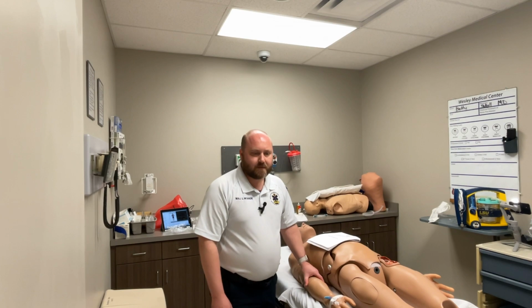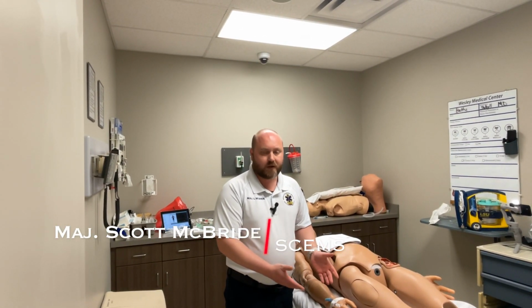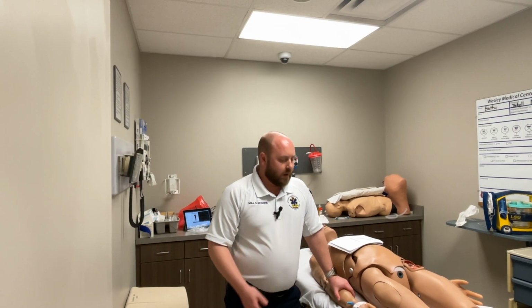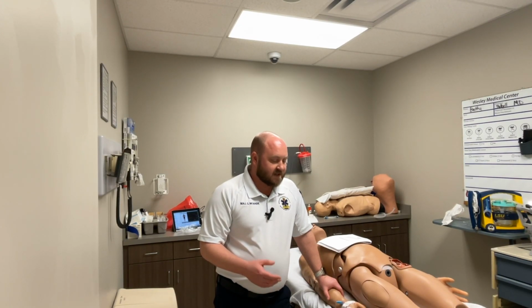All right, so IV bolus medication. The first thing we need to do is figure out, obviously, that you have an IV established. This can also be done intraosseously if you have an IO, so this skill can be done either way. It's just for the bolus of the medication and the med math behind it. So we're going to give, let's say, 75 mics of fentanyl intravenously.